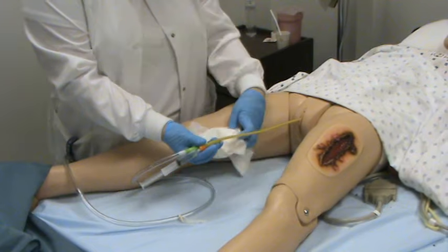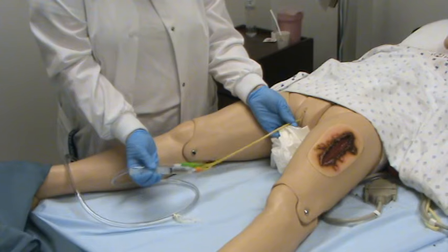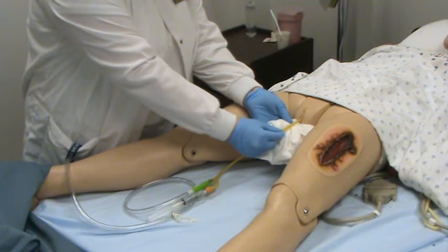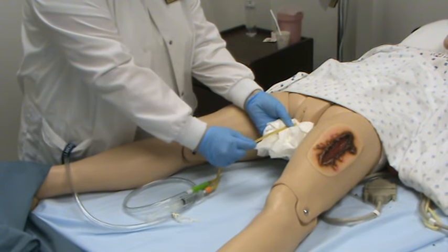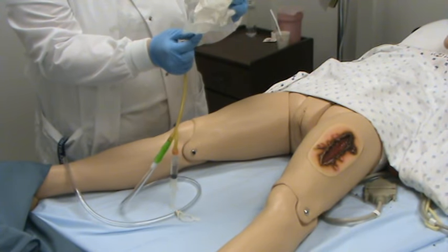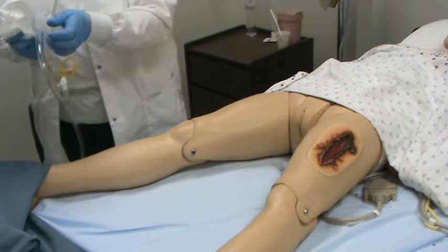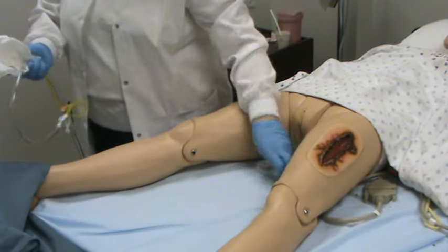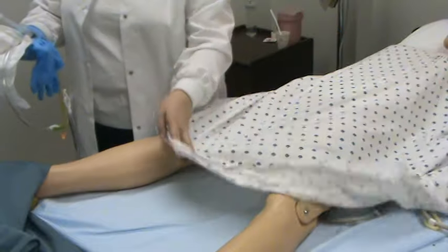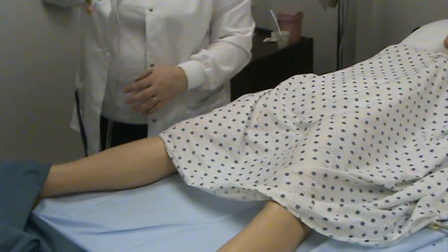While the fluid is coming back, hold on to the catheter so it doesn't slip out. Once all the fluid has come back, pinch the catheter and slide it out, keeping it at an upward position, and inspect it to make sure everything is intact. Take off your glove, cover up your patient, make sure the rails are up, and dispose of the bag in a biohazard container.